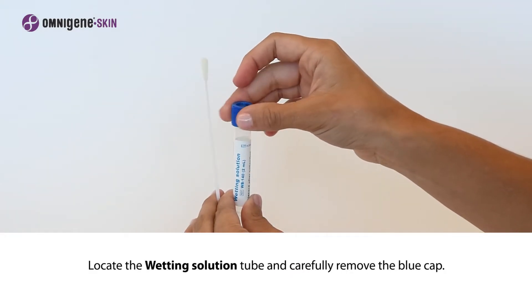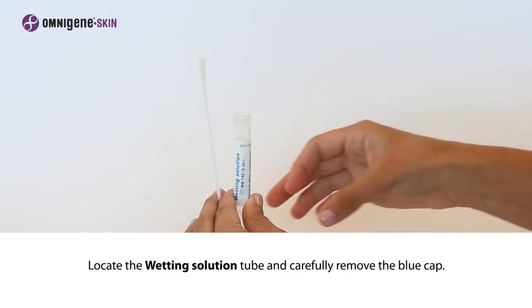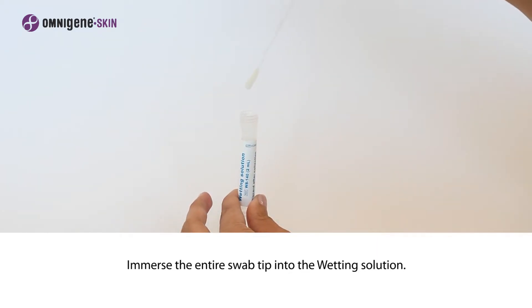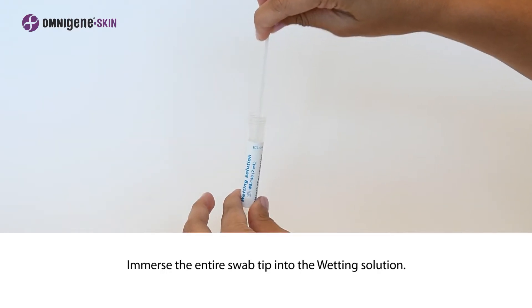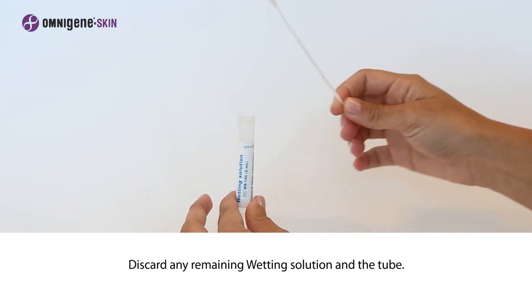Locate the wetting solution tube and carefully remove the blue cap. Immerse the entire swab tip into the wetting solution. Discard any remaining wetting solution and the tube.